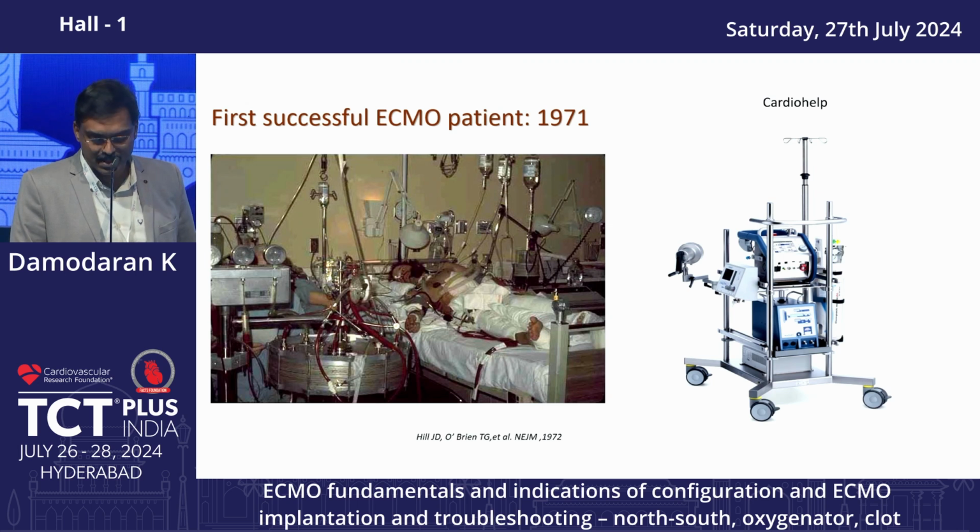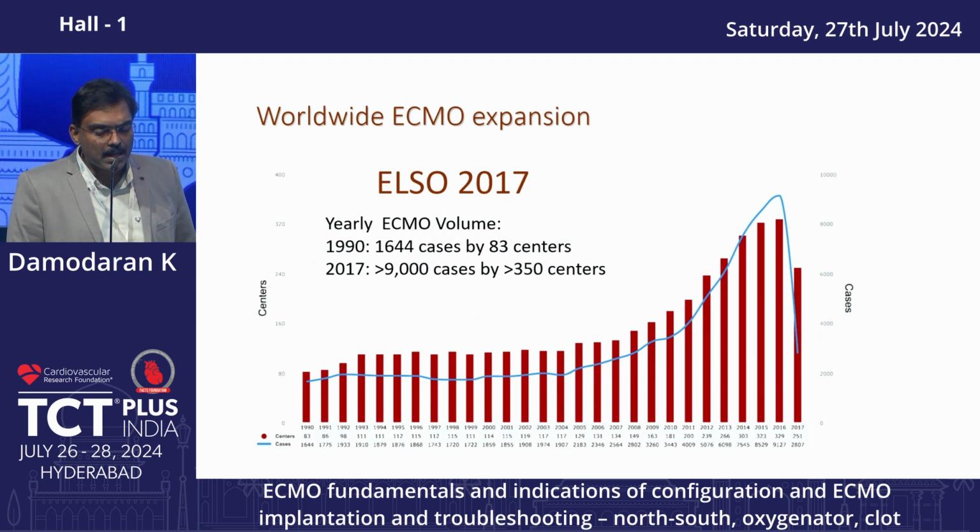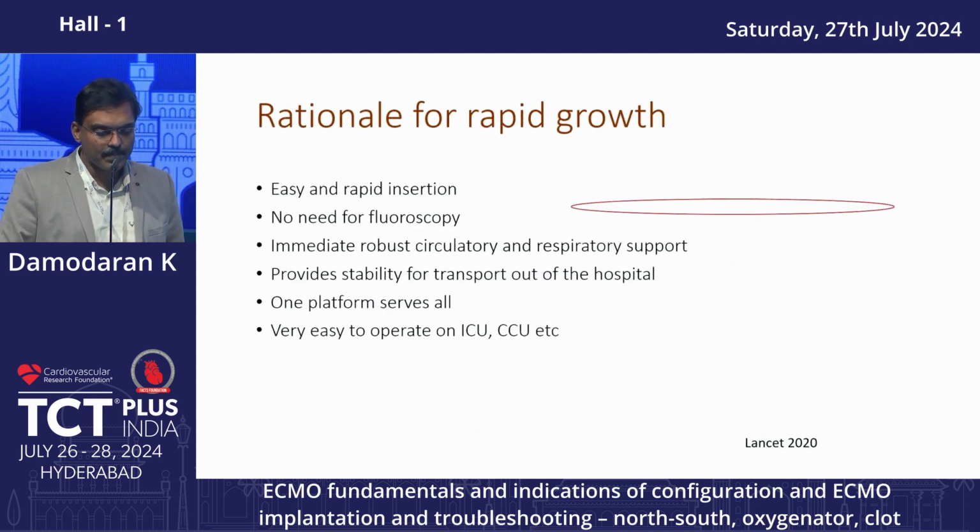You might have seen the familiar picture of people doing a resuscitation in the France railway station. That was a very popular image. Having said that, despite this device not being patronized by the industry, you will be surprised to see the rapid growth of ECMO. In 2017, more than 350 centers did more than 9,000 cases by ECMO. So this therapy has a real value in our daily practice.